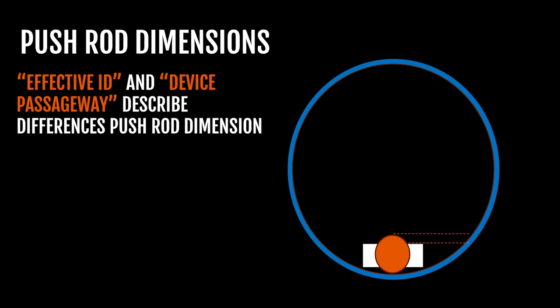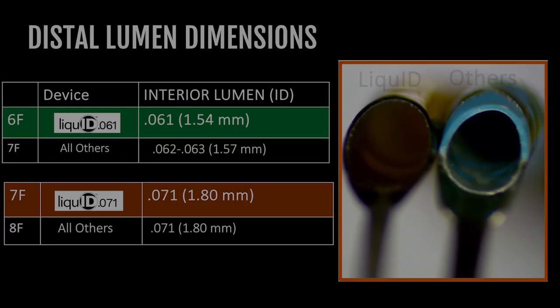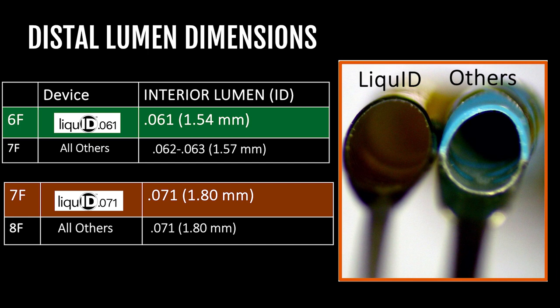We at Seigla would ask the question, so what? How is this clinically relevant? And simply put, what fits? Distal lumen dimensions are more important than push rod dimensions, and Seigla has designed the LiquID device accordingly.